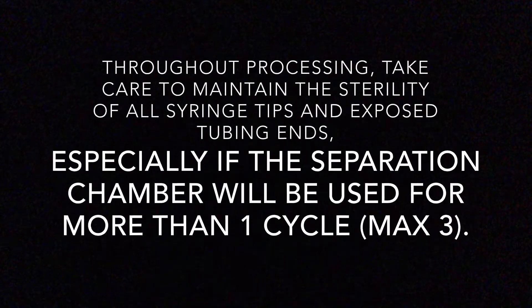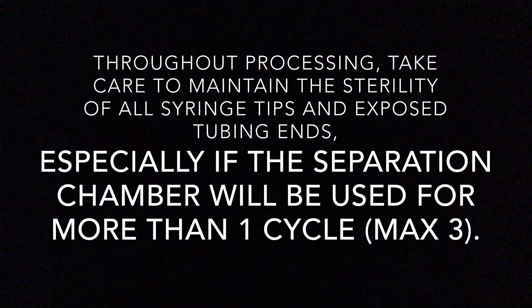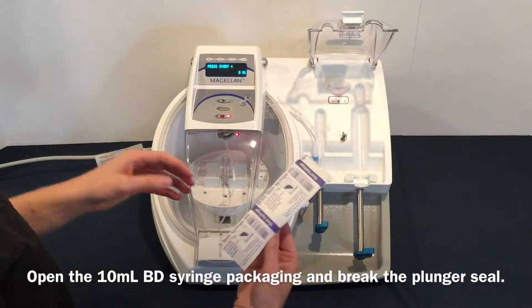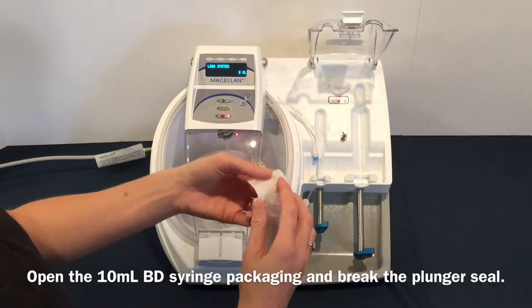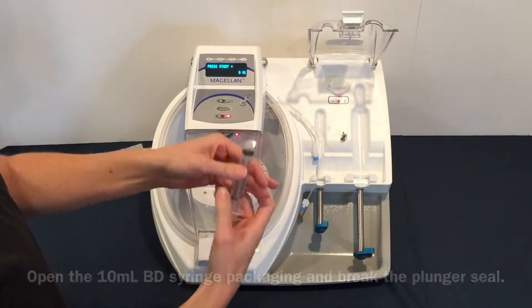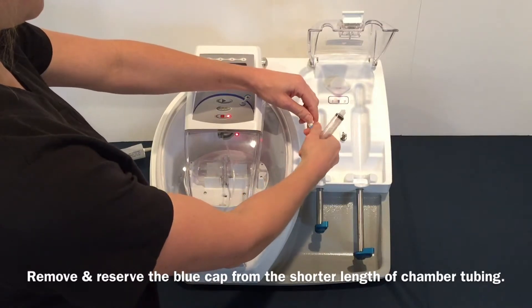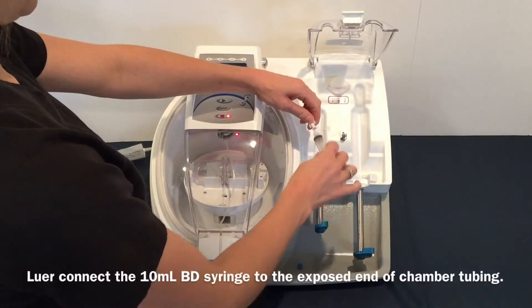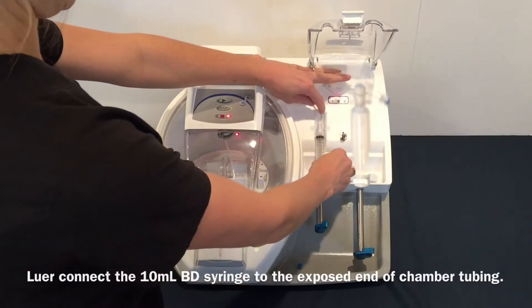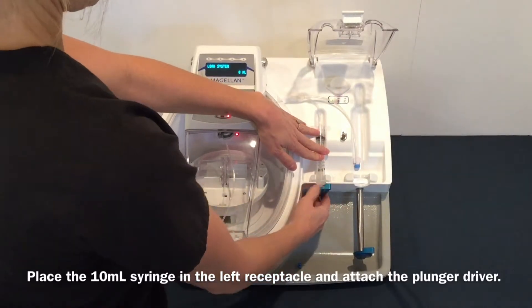Throughout processing, take care to maintain the sterility of all syringe tips and exposed tubing ends, especially if the separation chamber will be used for more than one cycle. Open the 10 mL BD syringe packaging and break the plunger seal. Remove and reserve the blue cap from the shorter length of chamber tubing. Luer connect the 10 mL BD syringe to the exposed end of chamber tubing. Place the 10 mL syringe in the left receptacle and attach the plunger driver.